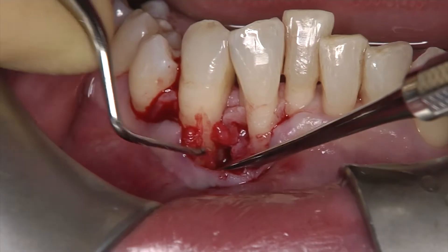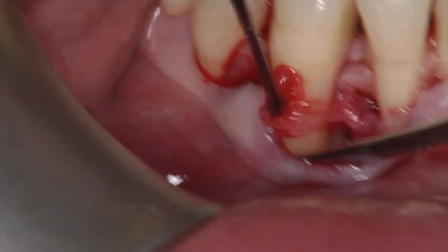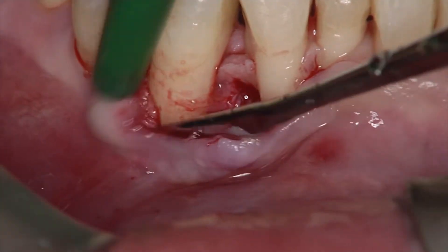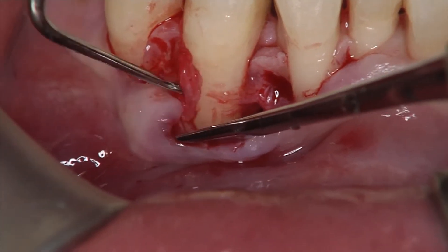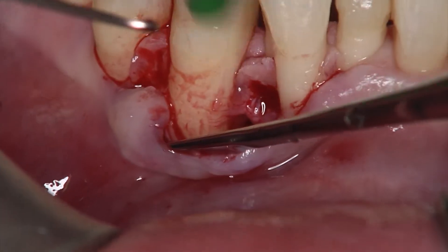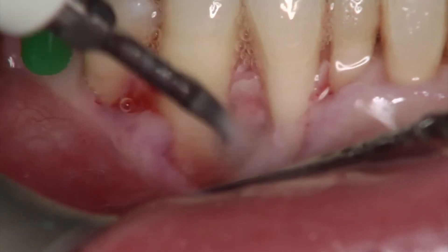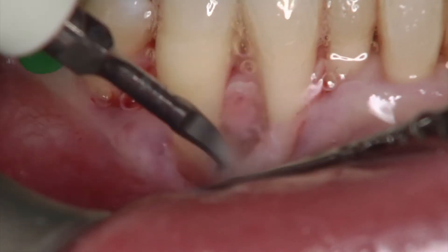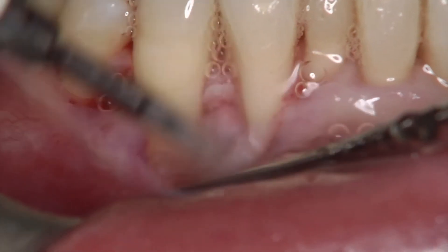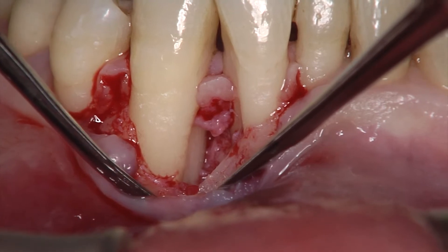The granulation tissue is removed from the defect by means of a small periodontal Hirschfeld file. The file should only be used to remove the granulation tissue, but not to scale the root surface. The Hirschfeld file is also used to decorticalize the internal part of the intra-bony defect in order to open the marrow spaces to facilitate the migration of mesenchymal stem cells from the bone marrow into the defect.